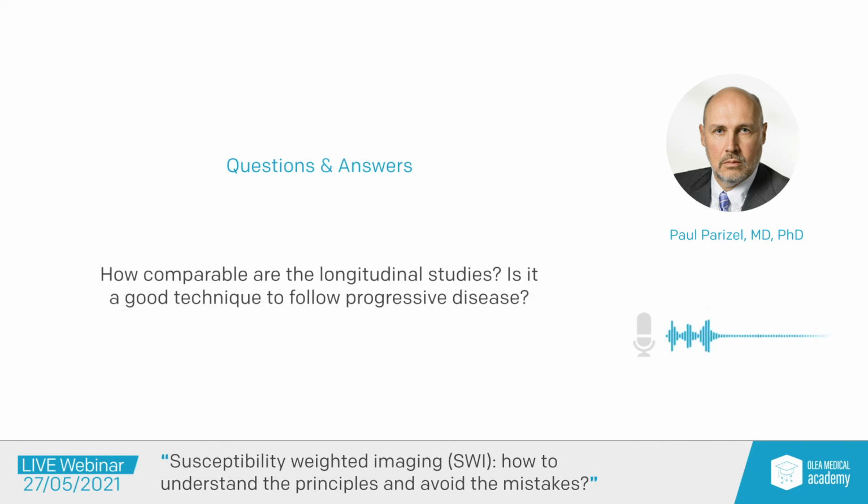Absolutely. We think it's a good way to follow longitudinal studies. And what many groups have been working on, moderately successful but not really completely successful, and I hope I'm not going to offend anyone, is to be able to express the number of lesions that you detect on SWI in a number.